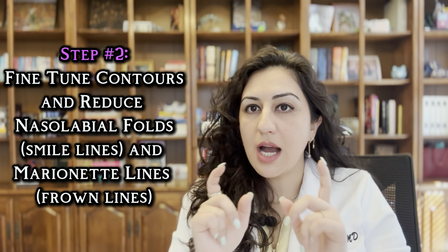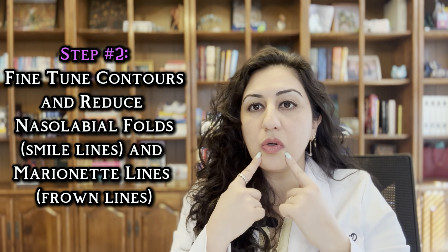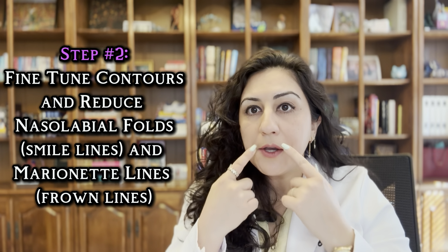So after you've done the cheeks and the jawline, the recommendation is for you now to evaluate the fine-tuning contours of the nasolabial fold and those marionette lines, okay? These things will cause shadowing on the face, and shadowing around the face is sometimes what will increase that aging appearance as we go about town. So a quick thing about nasolabial folds. They are our smile lines.